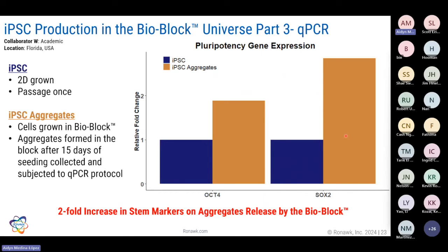We thought that maybe the cells were bad or something like that, but no, the cells were so happy they were getting out of the blocks, and they were still retaining those stem cell markers, which meant that we could use those cells for further investigation. Unfortunately, in terms of the differentiation, there were some problems with the reagents used, and differentiation didn't happen.